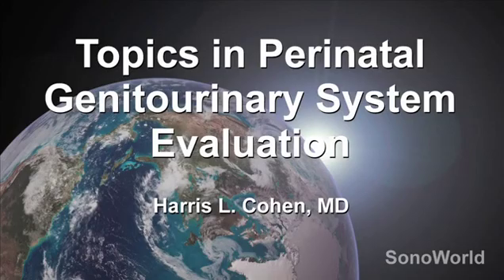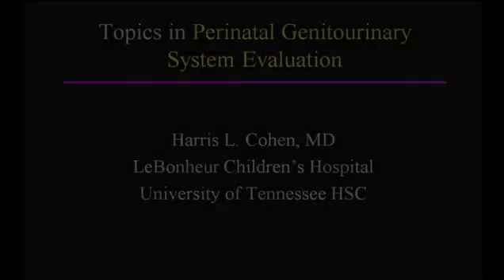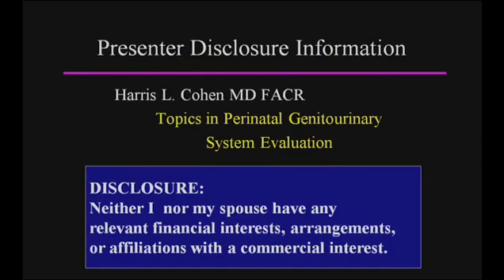I'm chairman of radiology at the University of Tennessee and radiologist-in-chief at Le Bonheur Children's Hospital, and we'll be talking about topics in fetal genitourinary tract evaluation. We'll be discussing some topics in the perinatal assessment of the genitourinary system, predominantly looking at ultrasound.